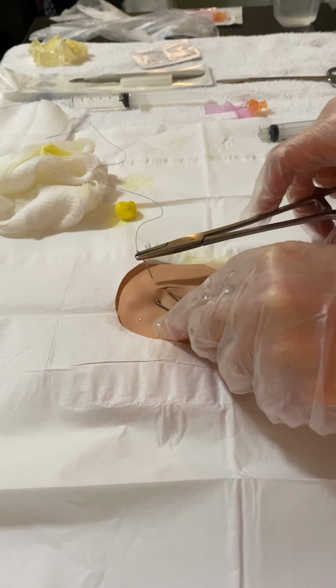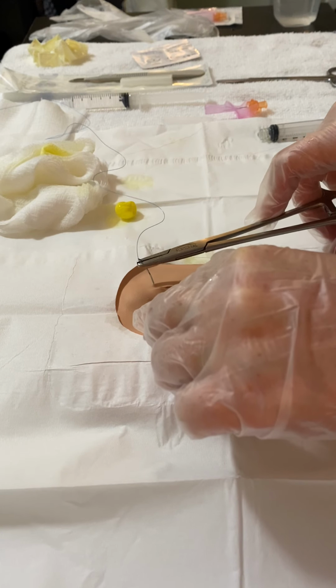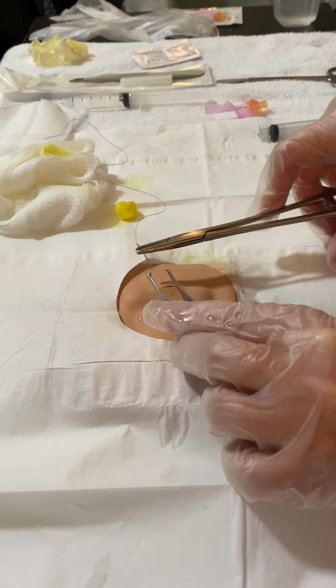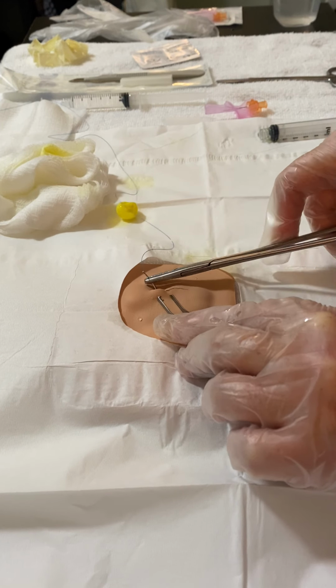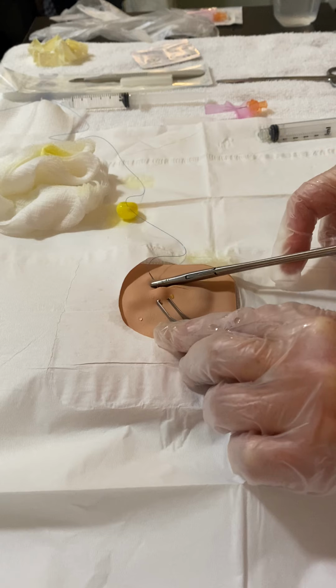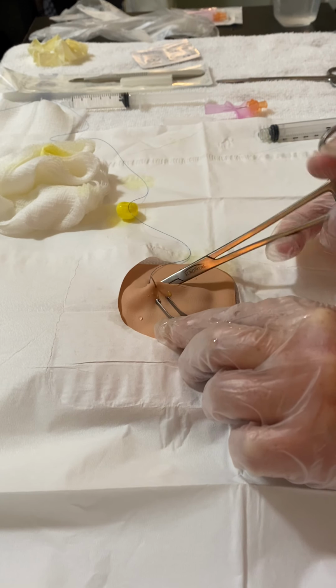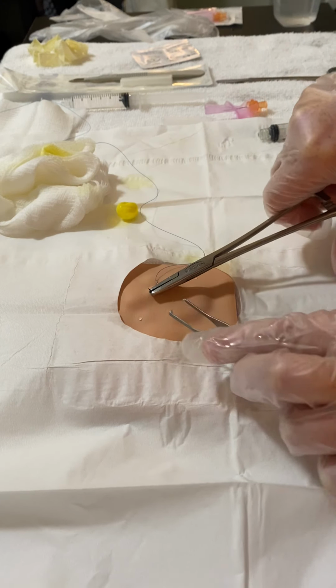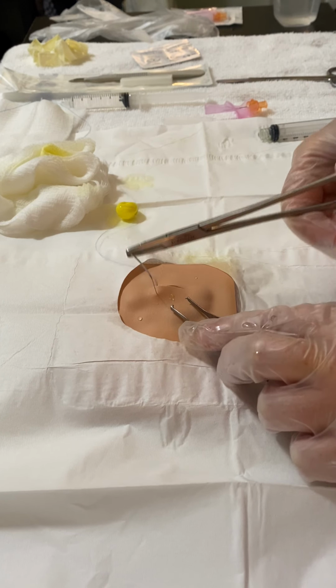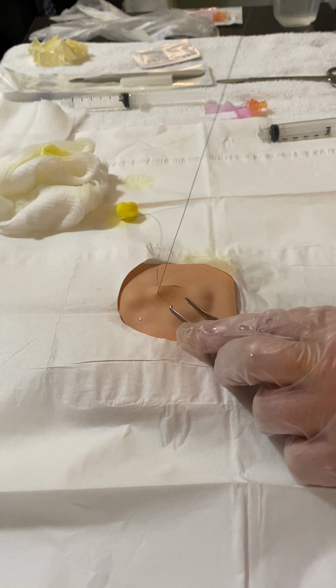So grasping the opposite side here, we could start to make a series of interrupted sutures. Making 2 bites here. And coming from the opposite side here.